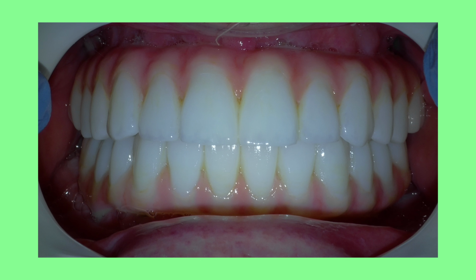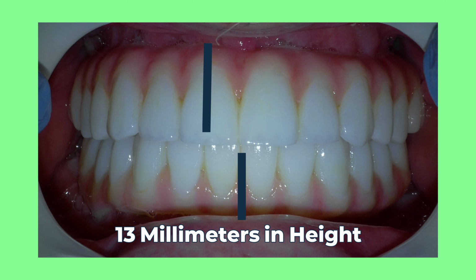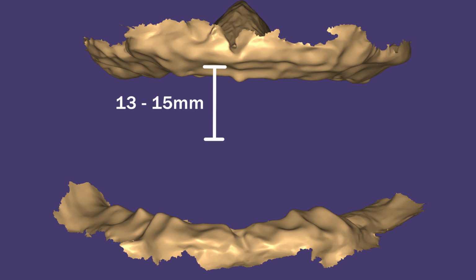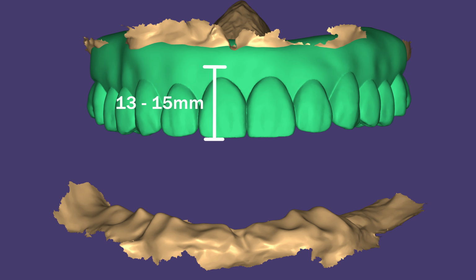So after that measurement, then we start to plan for the final implant dentures, and we want those to have a minimum thickness of 13 millimeters in height. But ideally, they would be around 15 millimeters thick or even more. We plan for the permanent denture at the end to have this thickness because at this thickness, it will be unlikely to break.